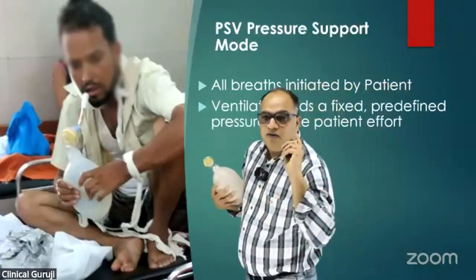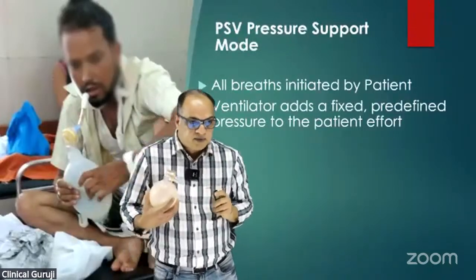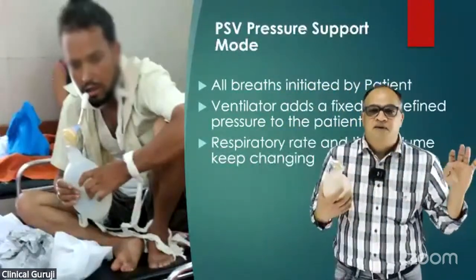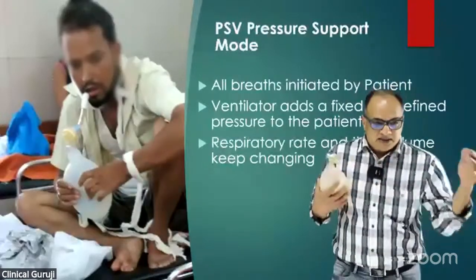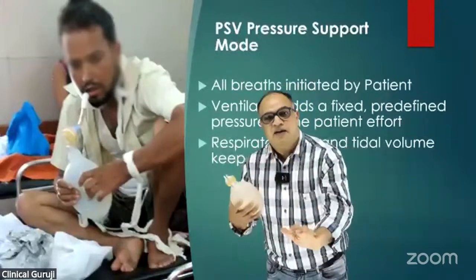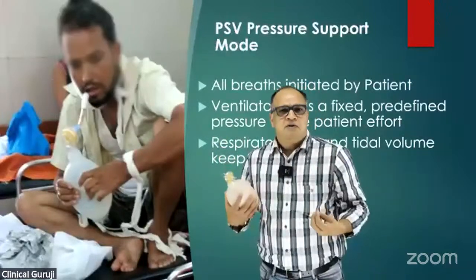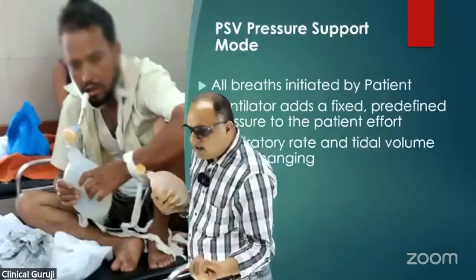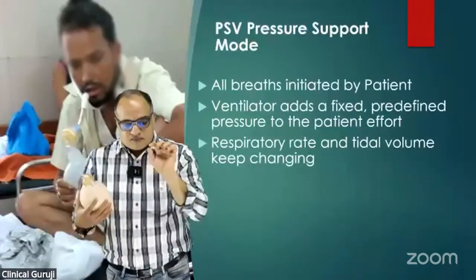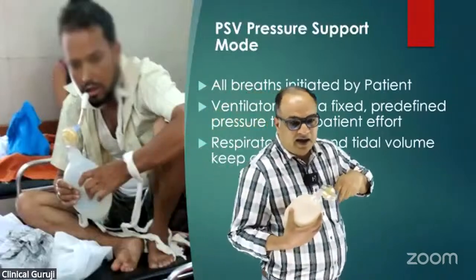Ventilator will give a fixed predefined pressure to the patient's effort. The respiratory rate and tidal volume will keep changing all the time. They will depend only and only on the patient's wish. If the patient takes a deep breath in and the ventilator gives 15 pressure, the tidal volume might go to 700. If the patient doesn't generate a big effort and the ventilator gives 15 pressure support, the tidal volume might go to 300 only. These things will keep changing and everything will be defined as per the patient's efforts.